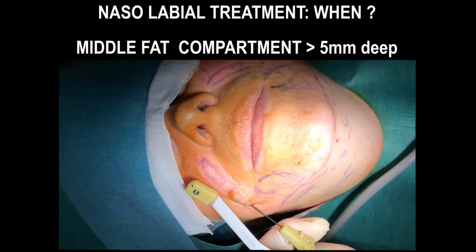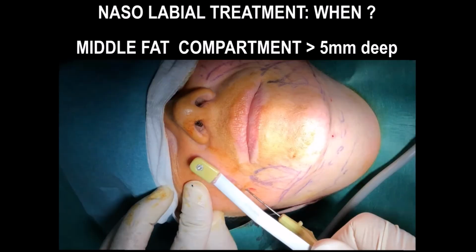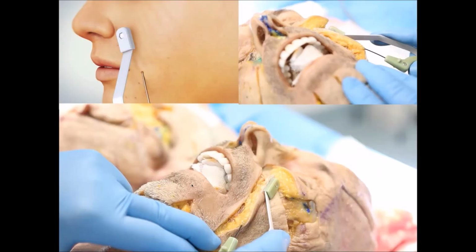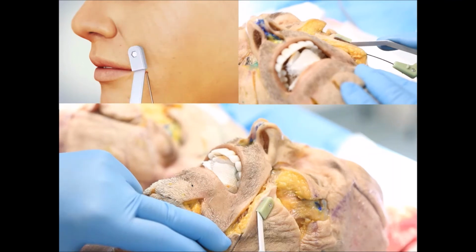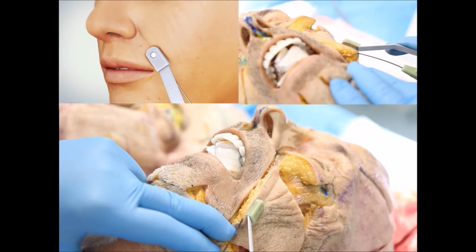So I don't think you can use the previous device that you have seen. This is really very superficial fat, so we are treating with this device. What you can see now is that I'm treating only fat. In this area, we can show it just after on the cadaver, but you will see that there is nothing very important. The facial artery is more medial and deeper, and here we have only fat and no nerve connection. So we don't have any nerve, and we can treat in a really safe way.